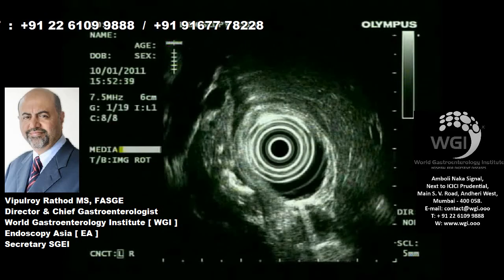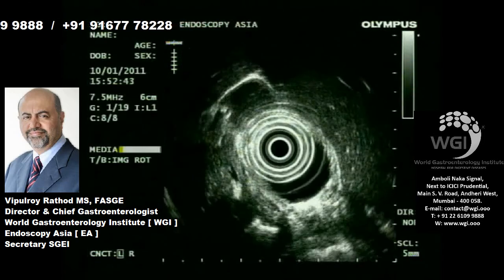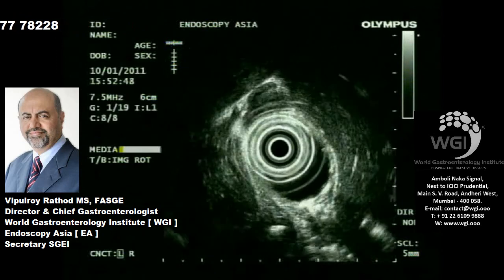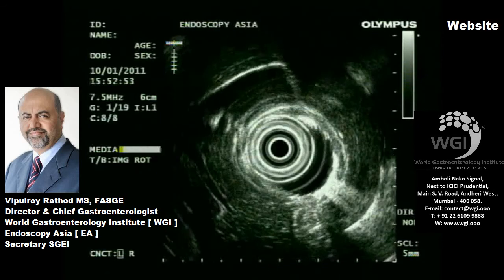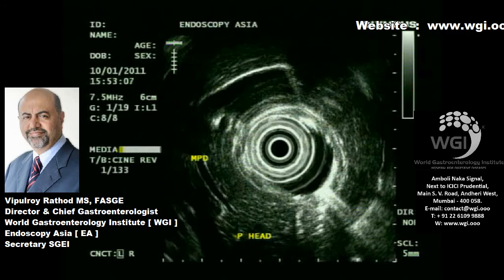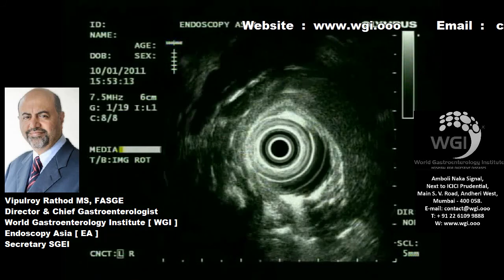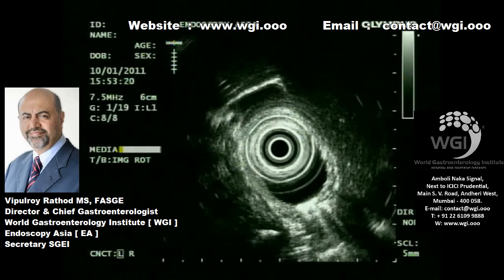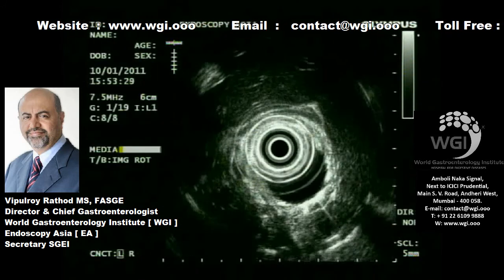This is not parenchymal calcification, and it looks like these stones are probably in the accessory duct. We are evaluating the pancreatic duct. You can see the pancreatic duct coming in the head region from the genu, and it does not appear dilated. So the predominant draining duct of the body and tail is not dilated, and there are a lot of stones sitting here — most likely in the accessory duct.